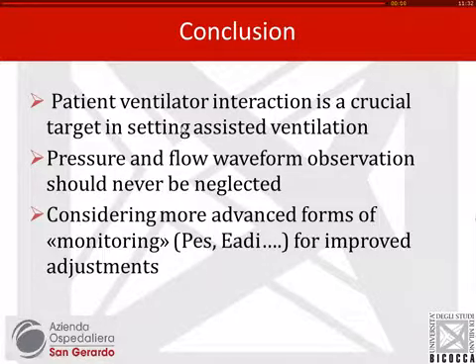Going to my conclusion, it's very important to take care of patient-ventilator interaction during the setting of assisted ventilation. It's very important already to look at pressure and flow waveforms, but I think that nowadays we have more and more availability of esophageal pressure, EAdi, and other tools will come in the future, and we should really look at what the patient is doing, not just what the ventilator is doing.